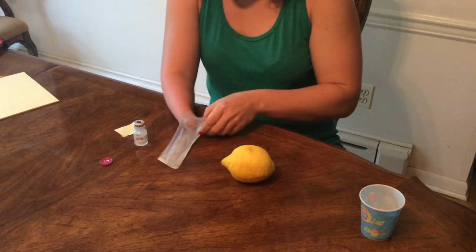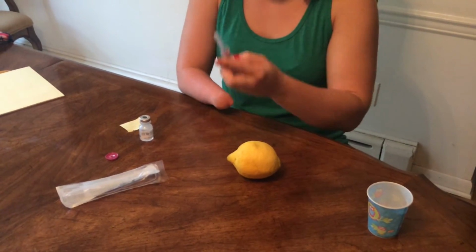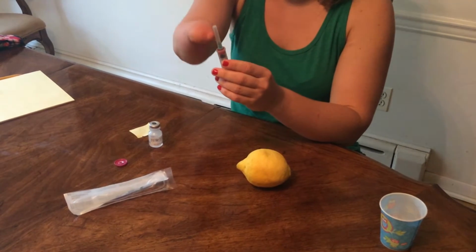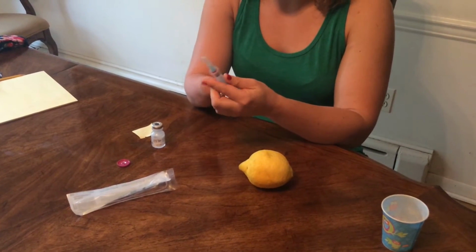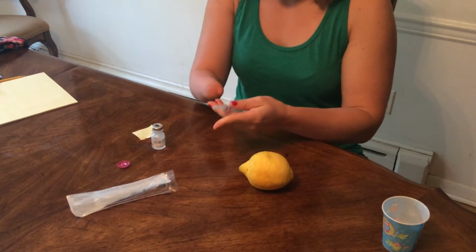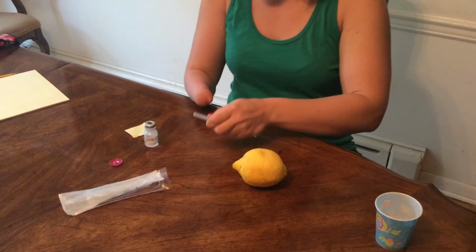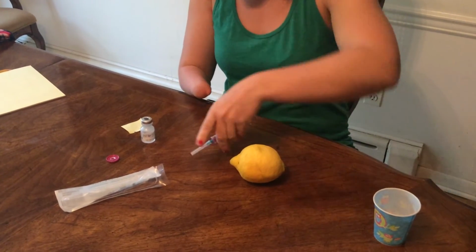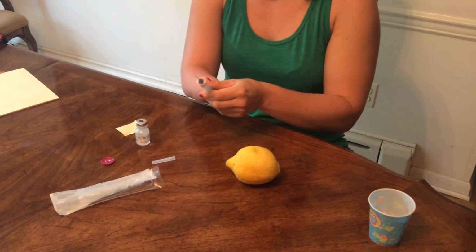So I'm going to take this out. Okay, so this is your IM needle. So we're going to keep this part straight. So a lot of people, usually they get nervous, they don't want to stab themselves. Some people like taking it off this way. I don't. I like to loosen it first and then drop it. And then you're not even in danger of stabbing yourself.